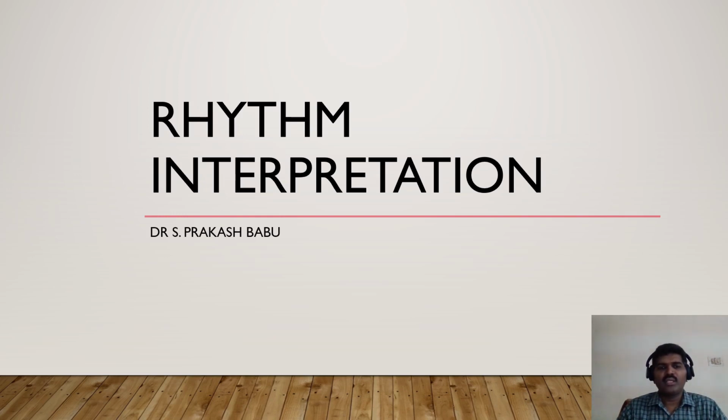In the coming few days, I will be doing lectures on ECG. We will be learning how to record a 12-lead ECG, how to interpret a 12-lead ECG, and also the rhythm interpretation.